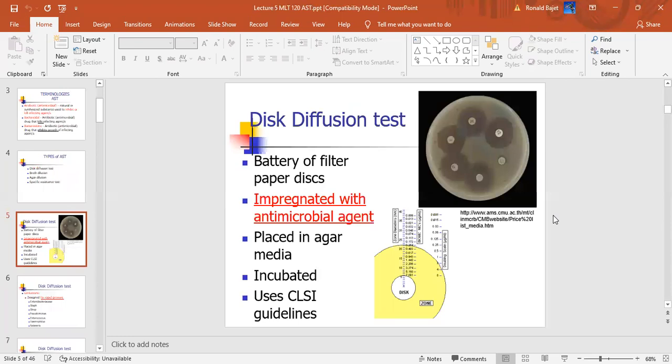Okay, so you see that plate there, and you see those zone sizes. Those zone sizes are the zones of inhibition. And the reason why there's no growth in these areas is because that's how far the antibiotic has diffused out into the agar radially. This particular antibiotic diffused out into the agar in a radial, circular fashion. If it was square, you would get squares, but because the impregnated disc is circular, you see the circles.